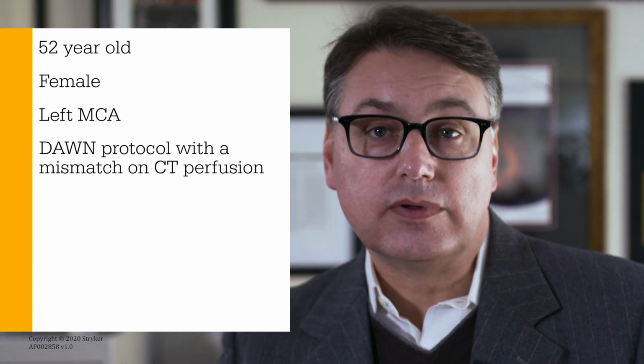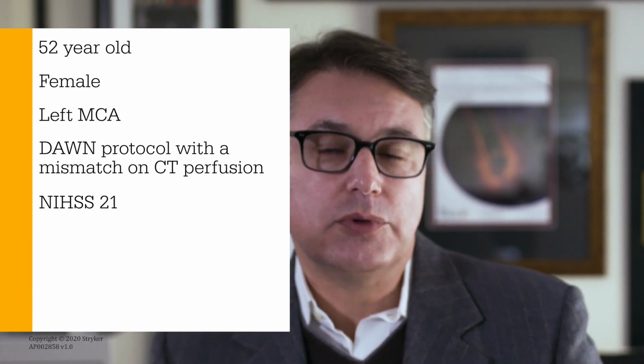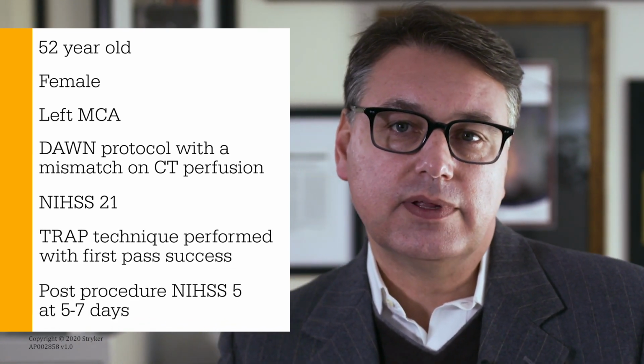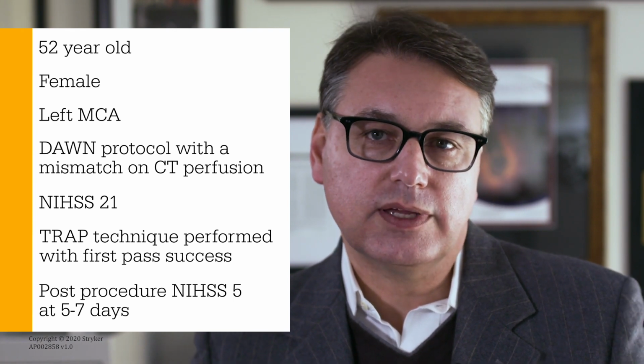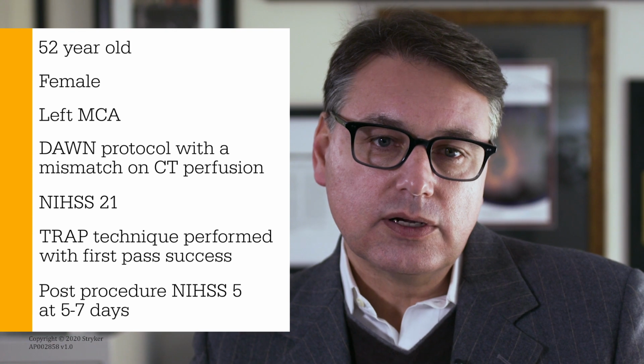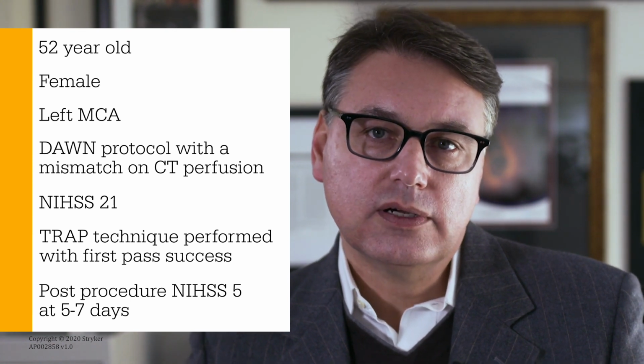We're going to go over the TRAP technique in this video. We had a 52-year-old woman come to us with an acute stroke involving the left middle cerebral artery. She was within the DAWN protocol, with a mismatch on CT perfusion, and her initial NIHSS was 21.